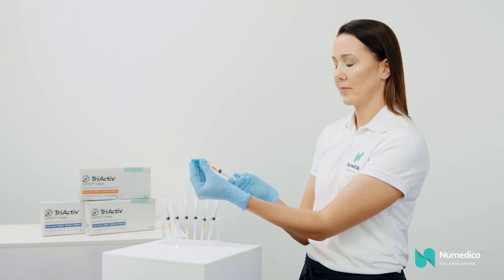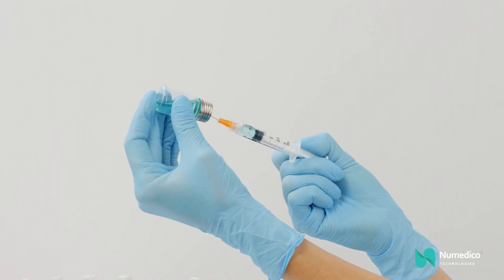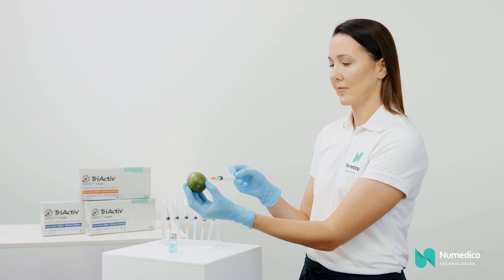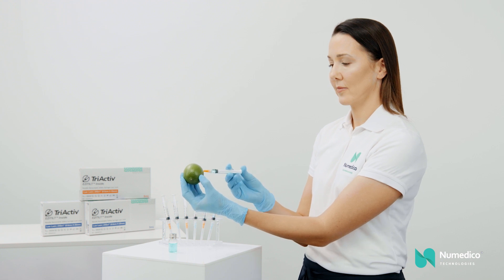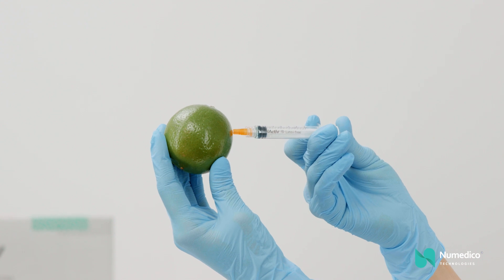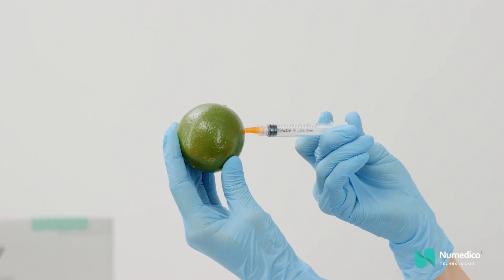Then draw out the medication using the standard aseptic technique, filling the syringe. Inject the medication, making sure to fully depress the plunger to engage the Tri-Active locking mechanism. A click will be heard.